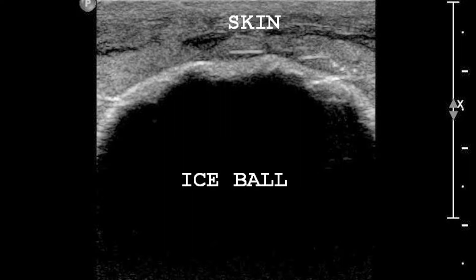So we can make sure that the whole tumour tissue is included in the treatment area. Since the ice ball is clearly seen during the procedure, it is very easy to protect the surrounding structures like the skin. If necessary, we can warm the skin or we can inject some fluid between the skin and the tumour.